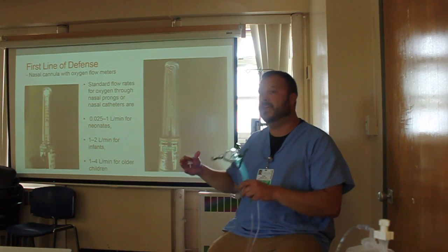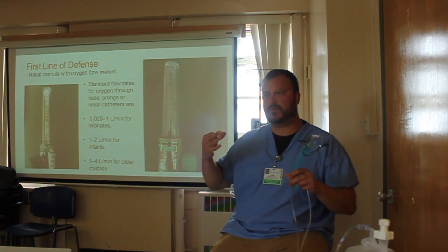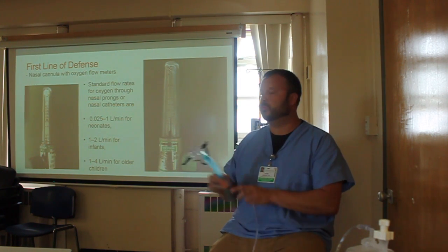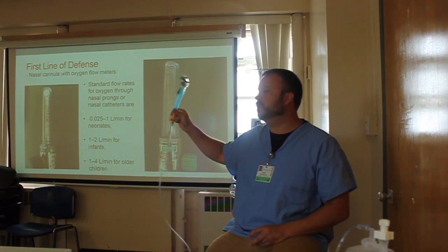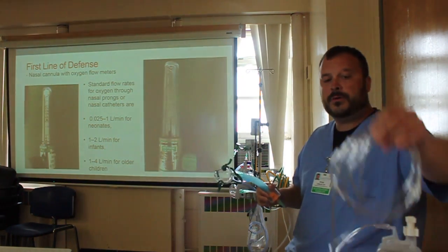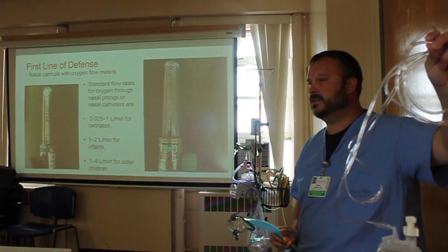That's ensuring that if they have an oxygen requirement, then we want to sort of help them with that work of breathing, but we're aiming more towards SATs. We're not gonna allow them to try to entrain any more air. We're just gonna take it over and say, this is exactly what you're gonna get, right? So it's a little bit more control. The problem with the nasal cannula is we don't know exactly what your patient is getting for oxygen on this nasal cannula.